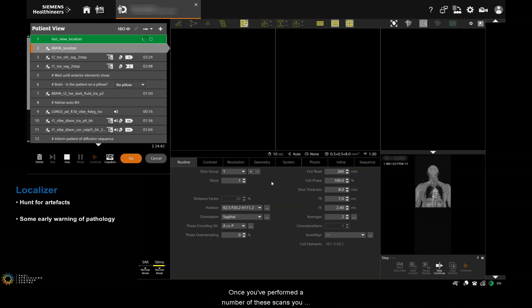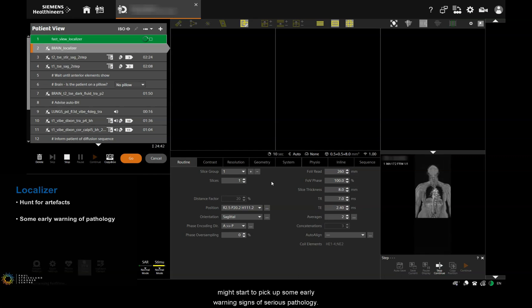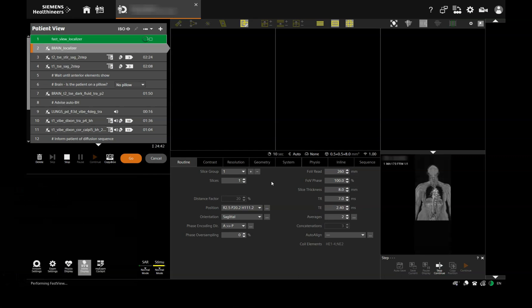Once you've performed a number of these scans, you might start to pick up some early warning signs of serious pathology.